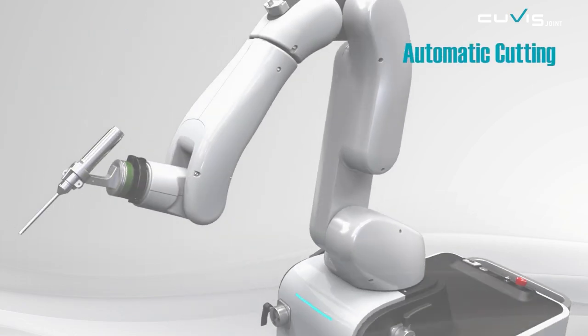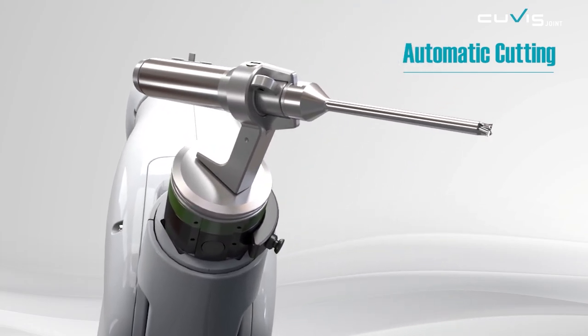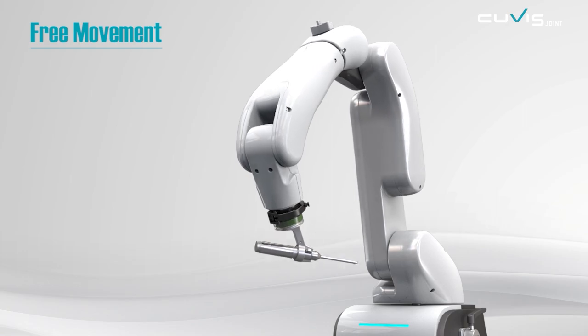Automatic cutting is the representative feature of CUVIS-joint, cutting precisely as planned while minimizing possible human error. The six-axis articulated robotic arm moves in a flexible and natural way.